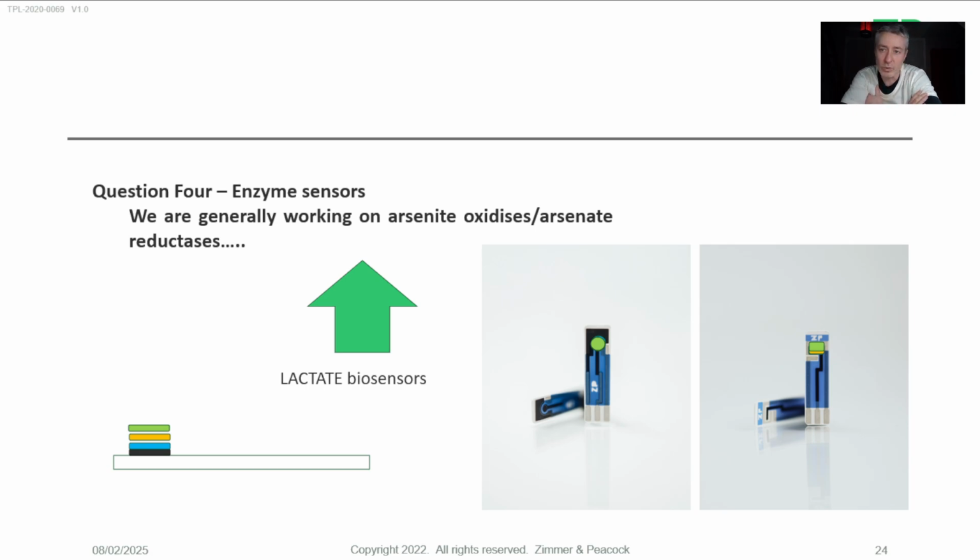Glucose sensors always use a barrier layer. We often use a barrier layer. So you may have an enzyme that may be functional but does not have enough activity. Well, you can preserve its activity and get a better application range. And when I say application range, I mean range of analyte concentration. A barrier layer is essentially blocking some of the analyte getting to the enzyme. So you're increasing the range of analyte concentration that you can actually detect.